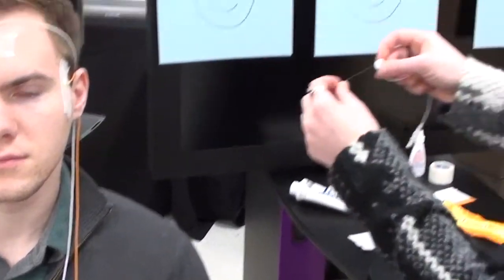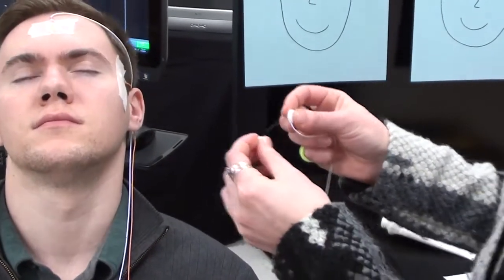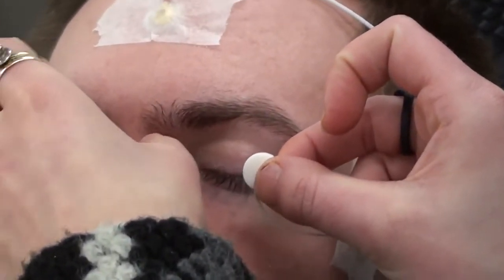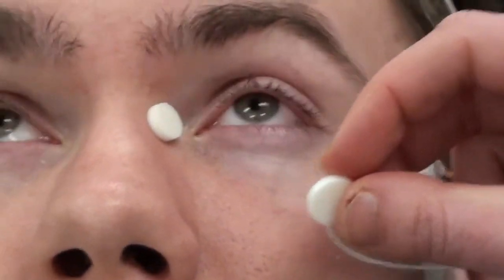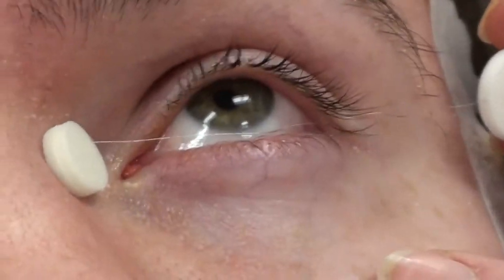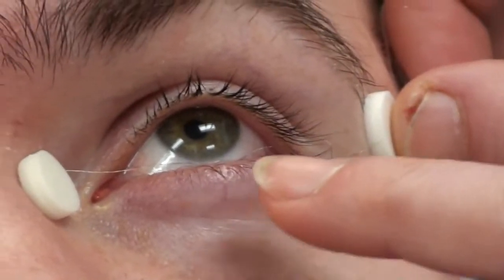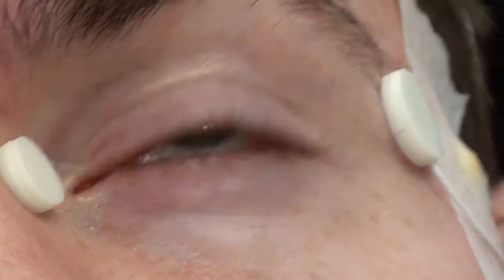We remove the DTL and ask our patient to please close their eyes and tilt their head back. We take the smaller sticky pad and place it right on the bridge of the nose at the inner nasal canthus. We ask the patient to open their eyes and gently press and apply, keeping it out of the eyelashes and on the surface of the lower eyelid. Then we take and tuck.